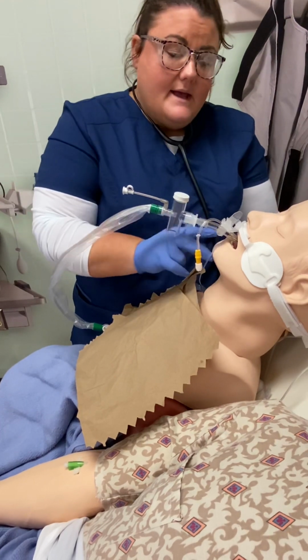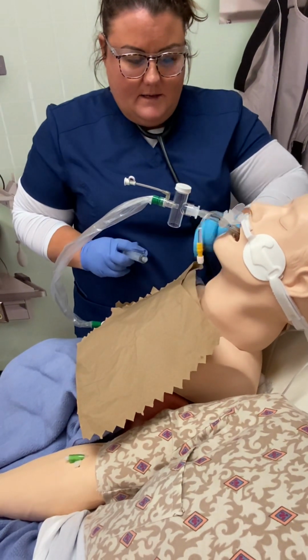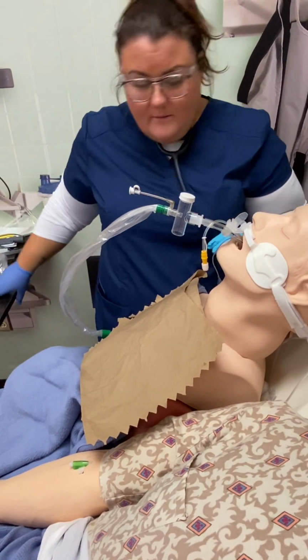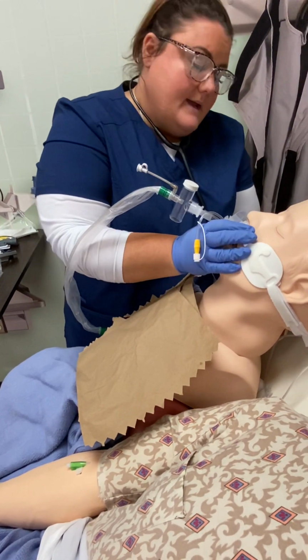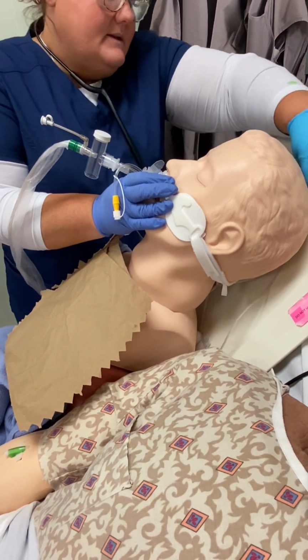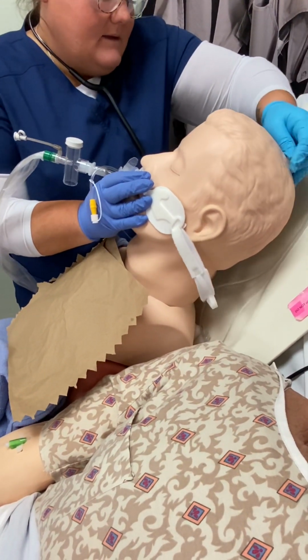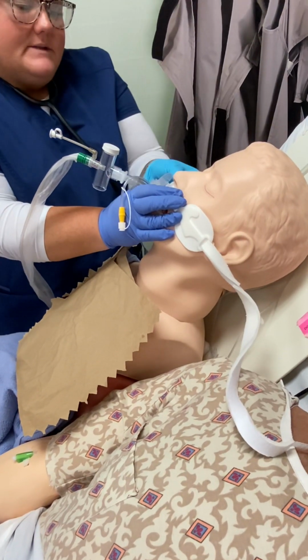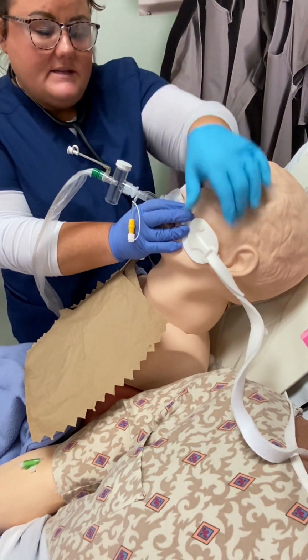So while he's doing that, I'm gonna go ahead and start to take this off to get it ready. Okay, I'm gonna slowly peel these off of his face.